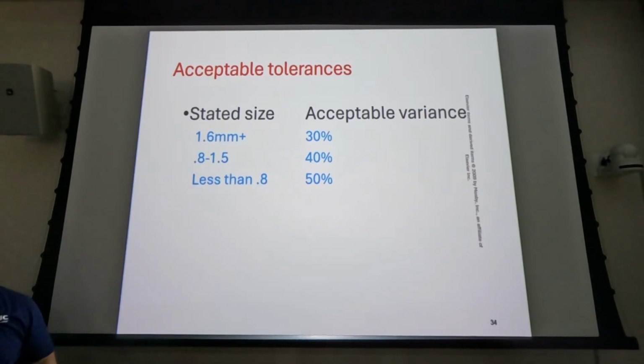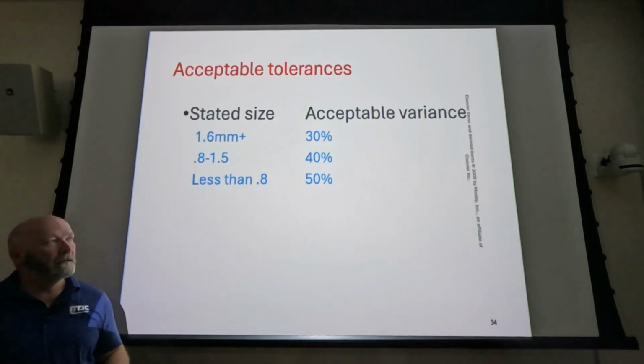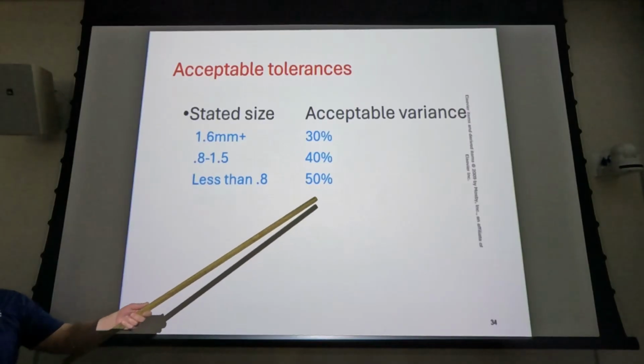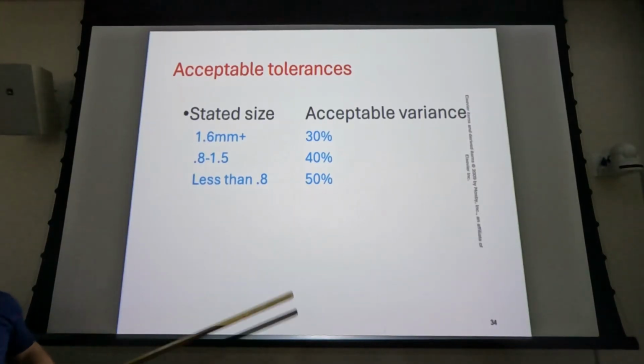So every year, a physicist or biomed guy, probably a physicist, is going to come in and do quality control on your machines. Okay, and they're going to measure everything. So if you have a focal spot size of 0.8, then your variance is never going to be smaller than 0.8, but it could be as much as, that would be a 1.2.